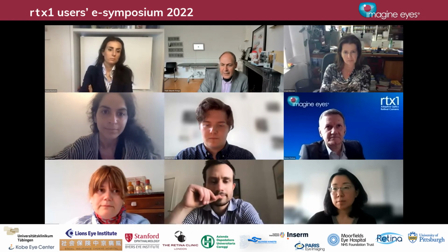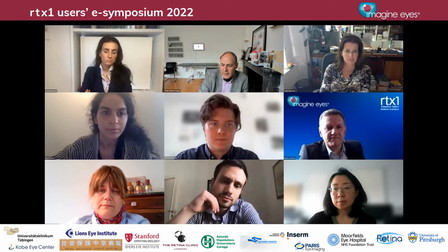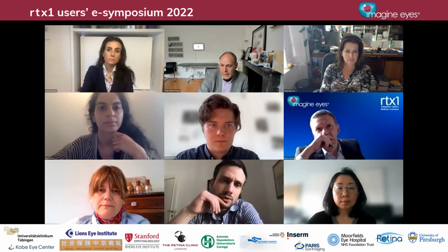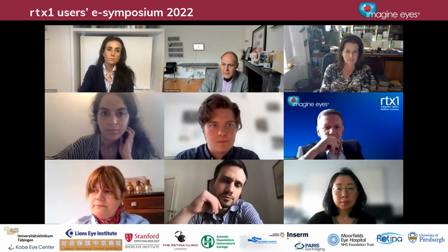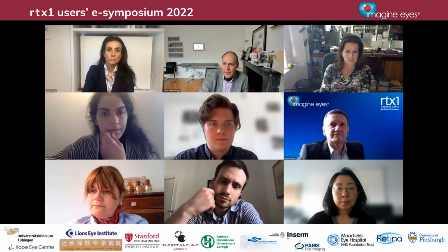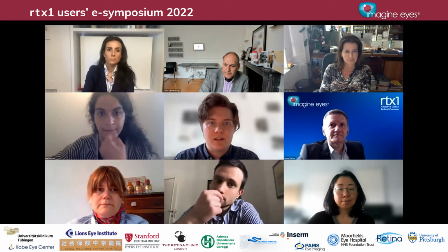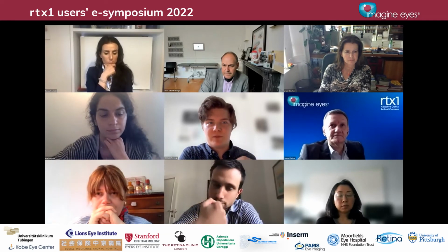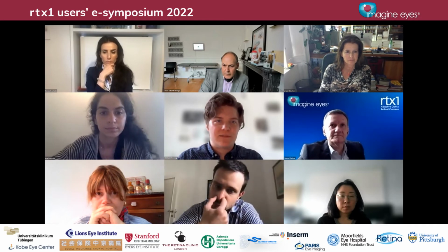Thank you. Nathaniel, very nice presentation. You certainly seem to be showing many more findings with your protocol. Have you had a chance to look at cuticular drusen? Is your technique protocol a better one for diagnosing or differentiating cuticular drusen? So we haven't looked too much into different kinds of drusen, but notably we're best on the small side where drusen progression really begins, versus a cuticular drusen is more developed, and I don't know if it would be as advantageous for this method.